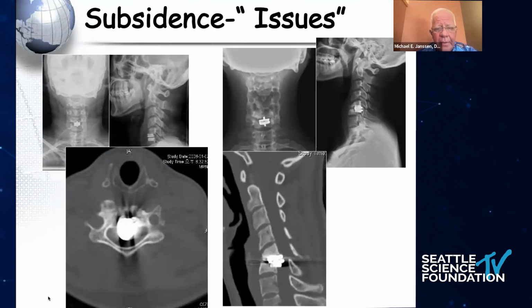You take the ALL out, you take the PLL out, there's probably some milling done. The implant's put in too far on the top right. The set of x-rays on the top left looks like the implant's not quite far enough because it's a mixed match, and that's not going to move.